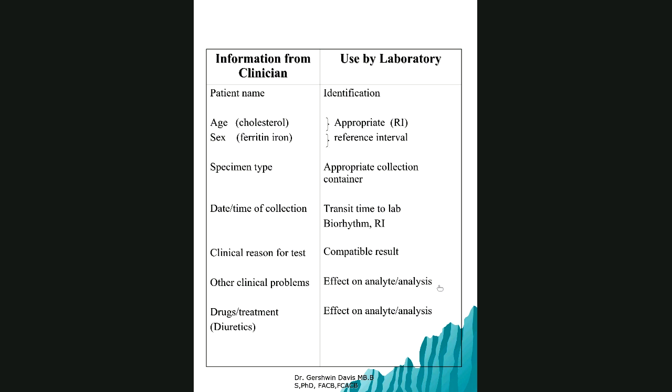You see your potassium is a bit on the low side. You see a history there, patient is on medication, and specifically on furosemide. Yes, this blood picture is in keeping with the clinical history of this patient. So that's why history is important in your lab request form. I hope that makes a little more sense.